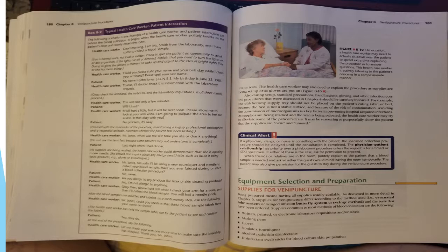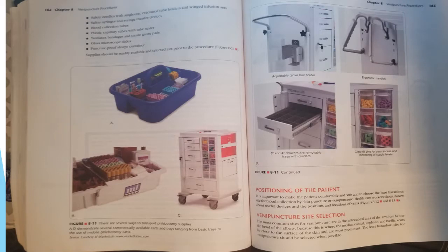Supplies common to most methods of blood collection are the following: written, printed, or electronic laboratory requisitions and/or labels, marking pens, gloves, non-latex tourniquets, alcohol pads, skin disinfectants, disinfectant swab sticks for blood culture skin preparation, safety needles with single-use evacuated tube holders and winged infusion sets, safety syringes and syringe transfer devices, blood collection tubes, plastic capillary tubes with tube sealer, non-latex bandages and sterile gauze pads, glass microscope slides, puncture-proof sharps container. Supplies should be readily available and selected just prior to the procedure.